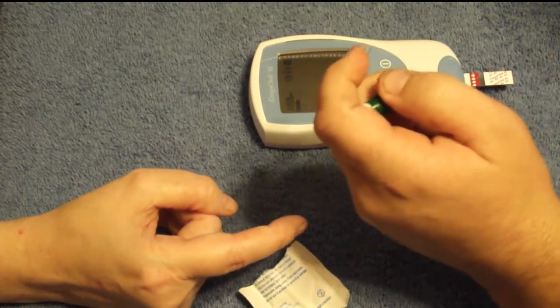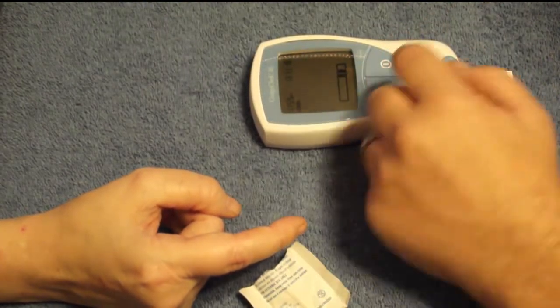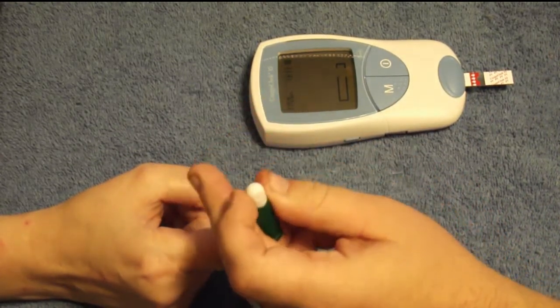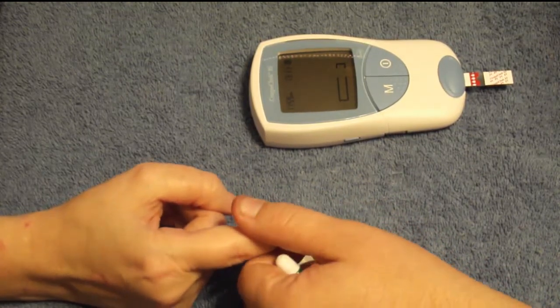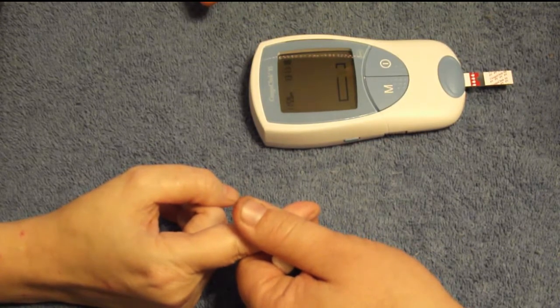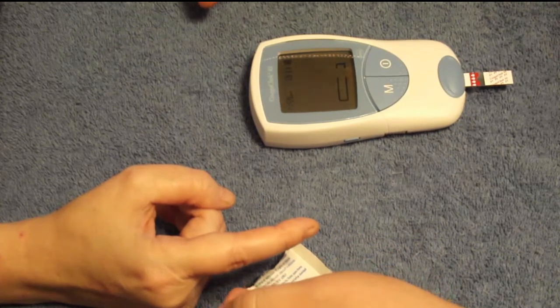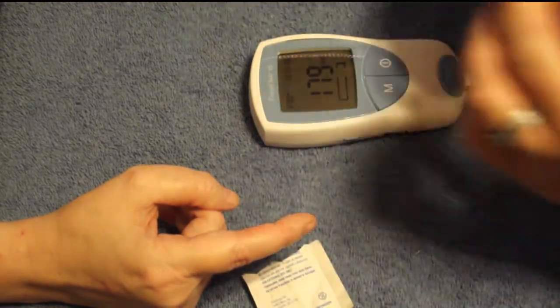It will ask you to make sure it's the right number of the bottle, which of course it is the same number. You tell it memory, and then the machine goes and starts into a warm-up process. You don't prick the finger or anything until you see it counting down. It does take a few moments, and it's counting down.